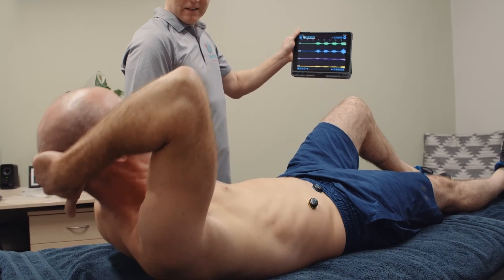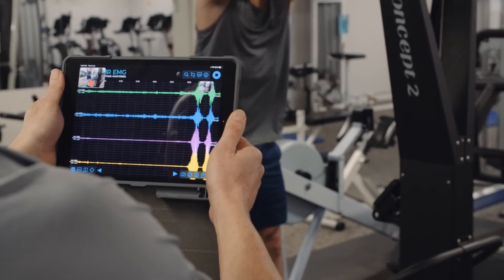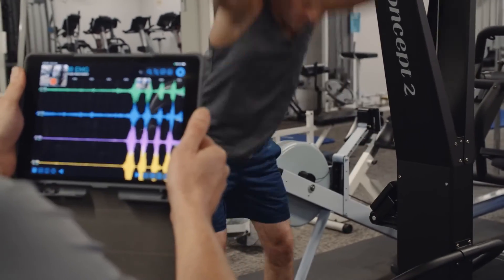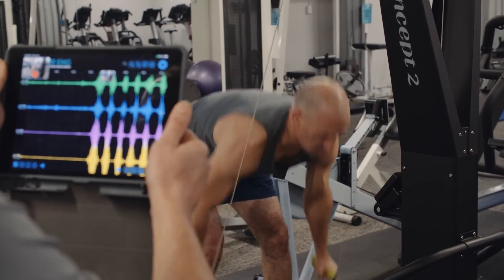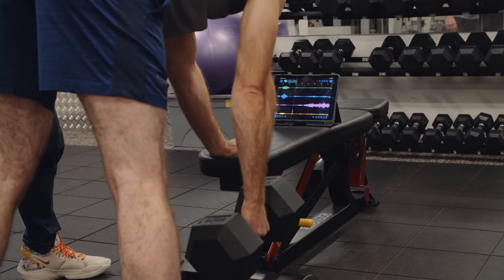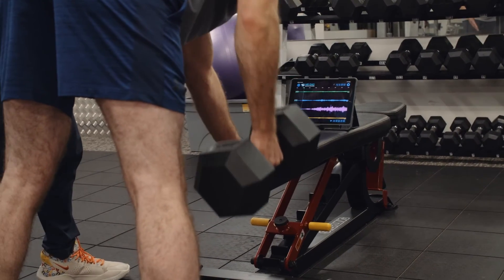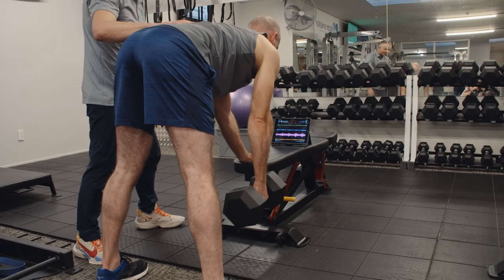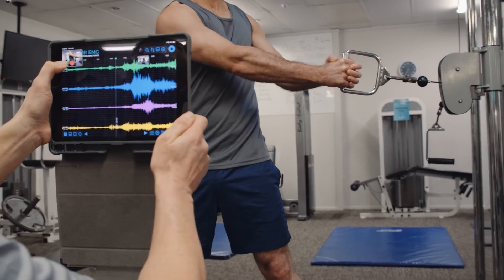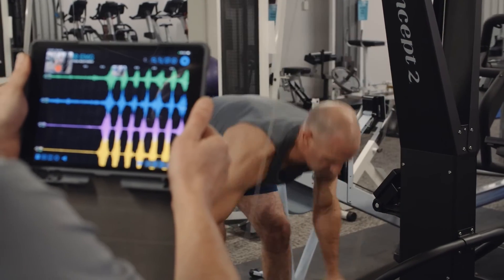Now record abdominal muscle activity performing activities of your choice to assess muscle engagement. We will complete our data gathering for this subject while performing other dynamic exercises using gym equipment. Here are some examples: one arm dumbbell rows, oblique twists using a cable, finishing with cardio on a ski erg.